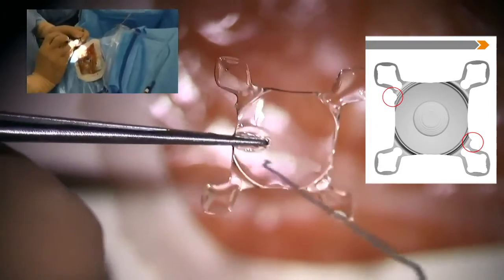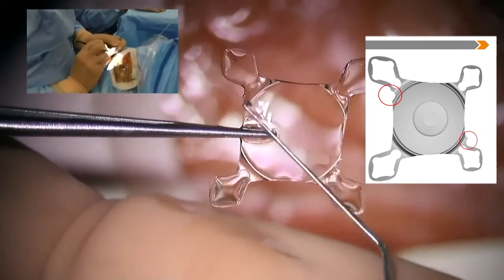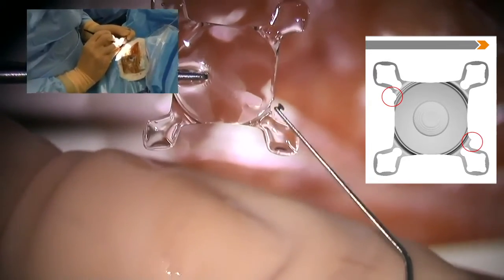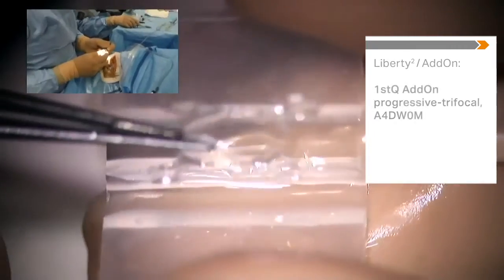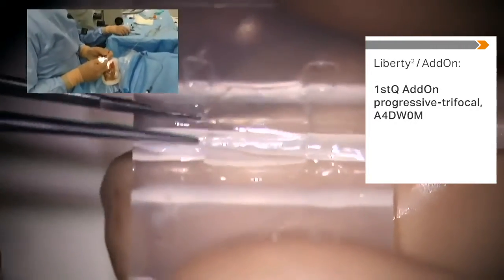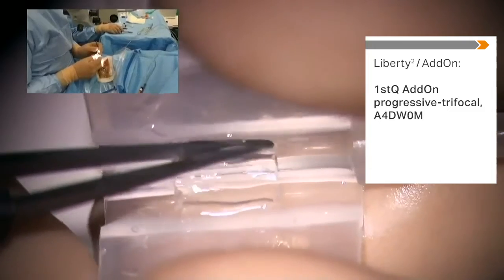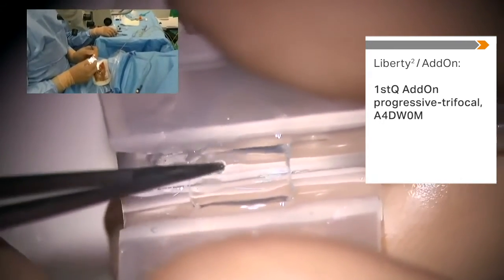You see here a slight edge here, and there is a half circle in this part of the lens, and this helps me to align and to identify the back face and the surface of the lens properly to avoid an upside down implantation. If you have an upside down implantation, you have to remove the lens.